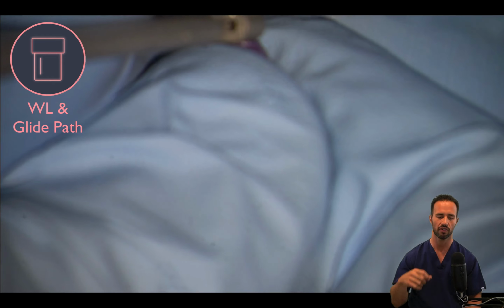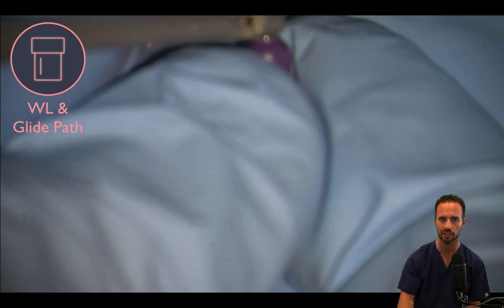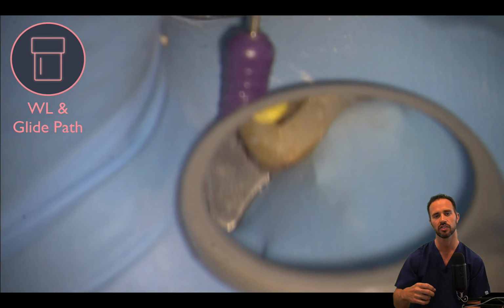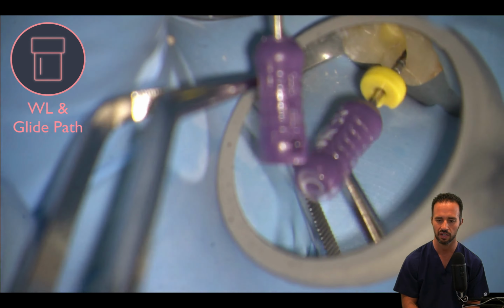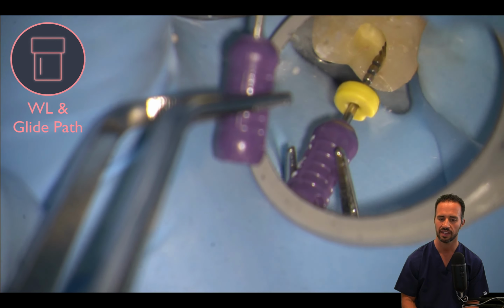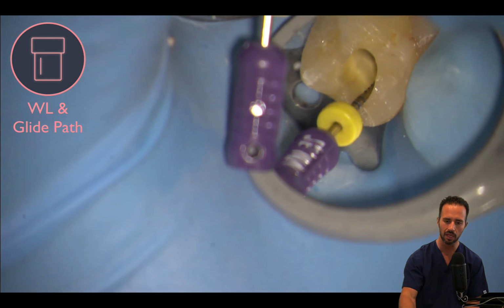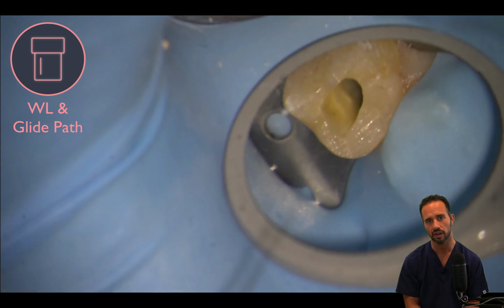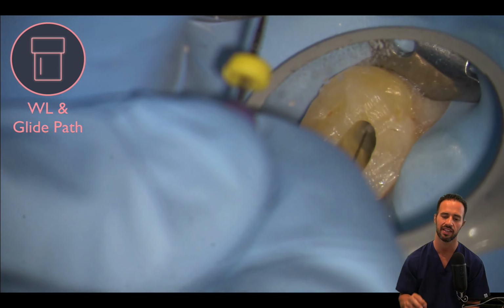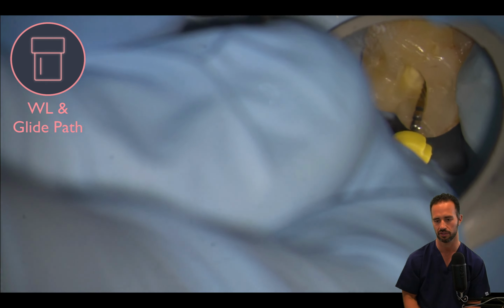So here we've progressed obviously to our working length determination and our glide path preparation. And I got my 10 file here. This is a 10C file, and it's being introduced into our MB. Our apex locator was put on, and we're finding that the working length for our mesiobuccal canal is 18 millimeters.